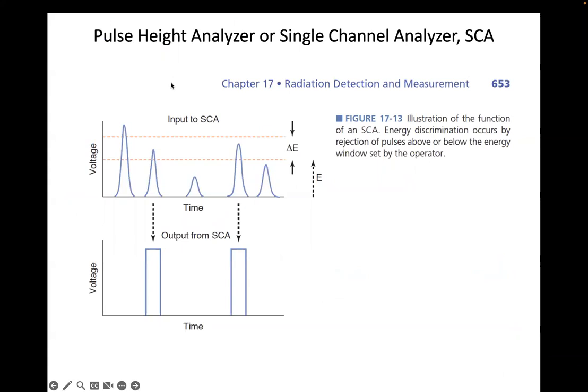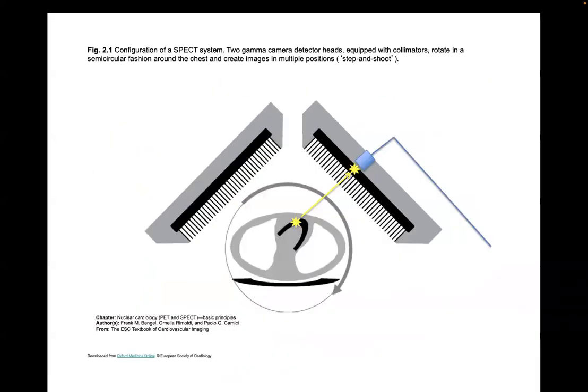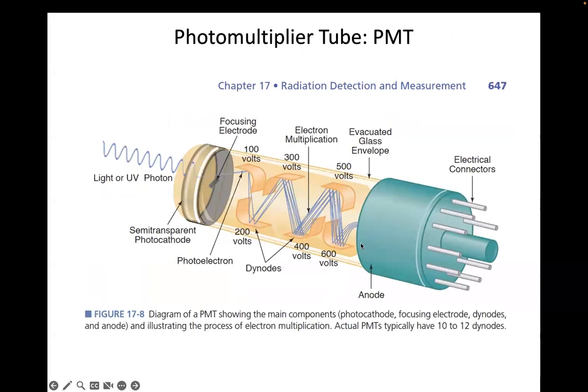And then part of the system is determining, is the signal that's coming out of that photomultiplier tube from a primary gamma ray that came from the patient? And so if we go back here and we say this primary gamma ray made a flash of a certain brightness, and then we get a pulse height, which has the number of electrons here and a charge of a certain amplitude.